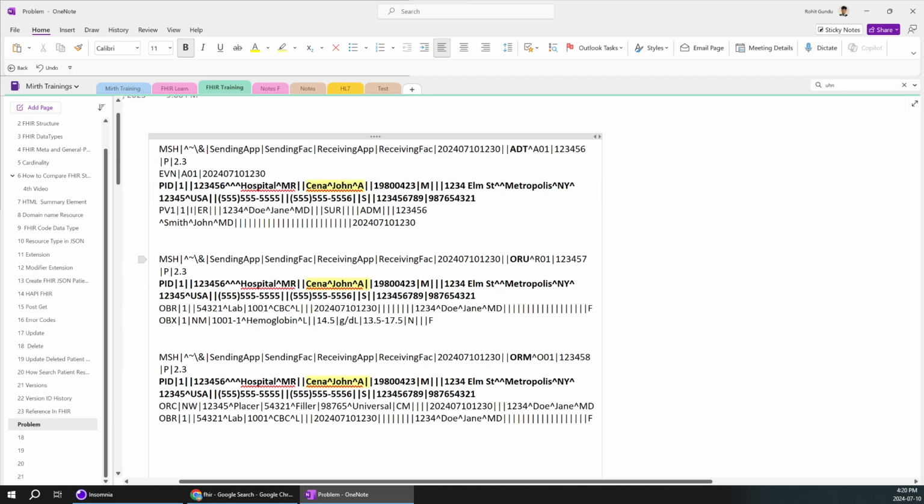Again, we'll be sending it in ORU and orders. Wouldn't it be enough just giving an MRN, an ID or something like that? That would be better, right? Or else give some web link that would make it easy to identify that he is John Cena. So we are going to solve that problem in FHIR.